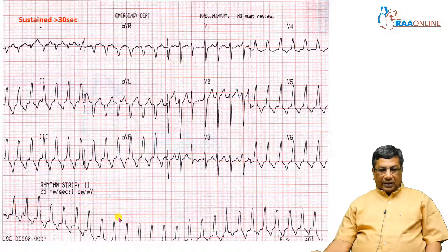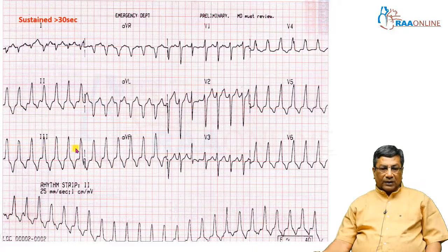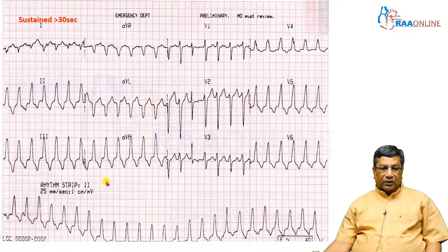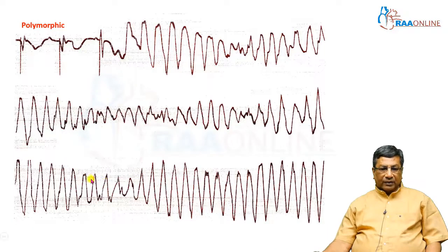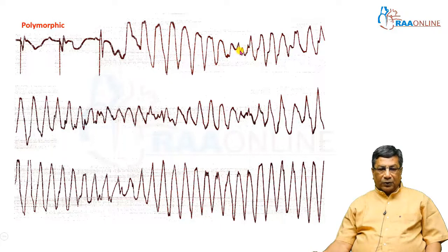In wide QRS complex tachycardia, you must check in a given lead whether all QRS complexes are of similar configuration. Look at lead 3 here — all QRS complexes are similar, so it is a monomorphic wide QRS complex tachycardia, fired from a single ventricular ectopic pacemaker. Whereas in this wide QRS complex tachycardia, each QRS complex is different in height, direction, width, notches, and amplitude — this is a polymorphic wide QRS complex tachycardia, most often torsades de pointes.